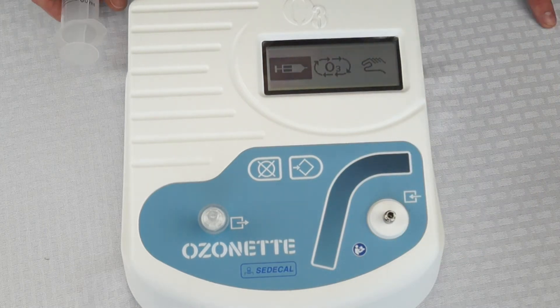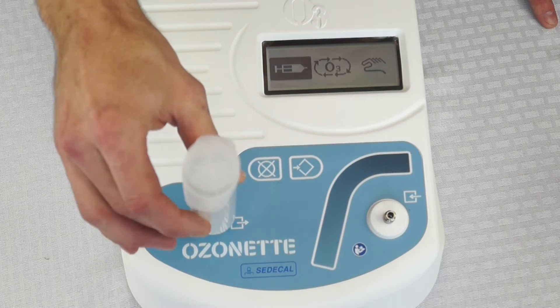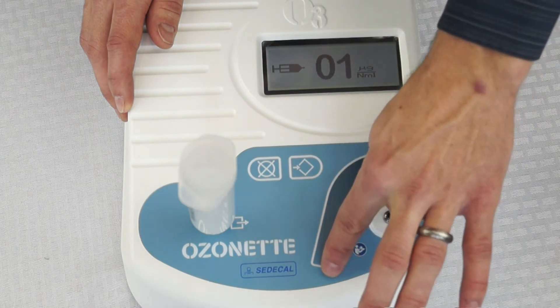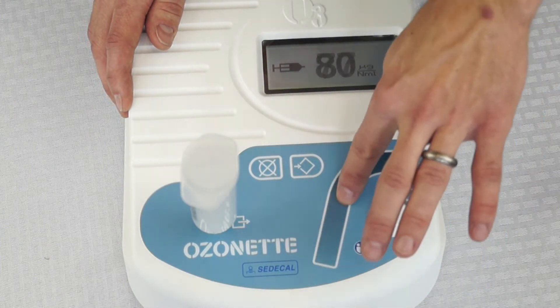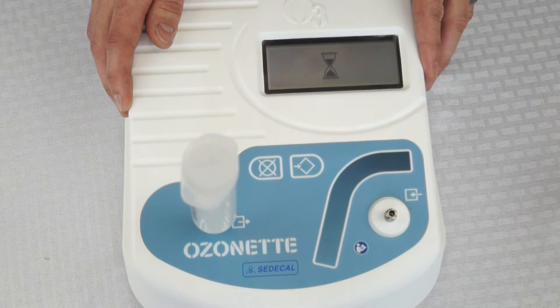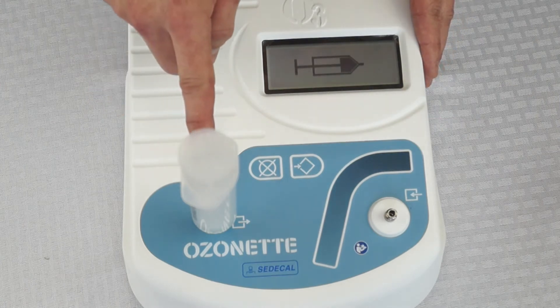If we simply want to draw up ozone into a syringe, we connect our syringe first, then hit enter. We select our concentration value anywhere from 1 to 80, then hit enter and the Ozone Net will automatically fill the syringe.